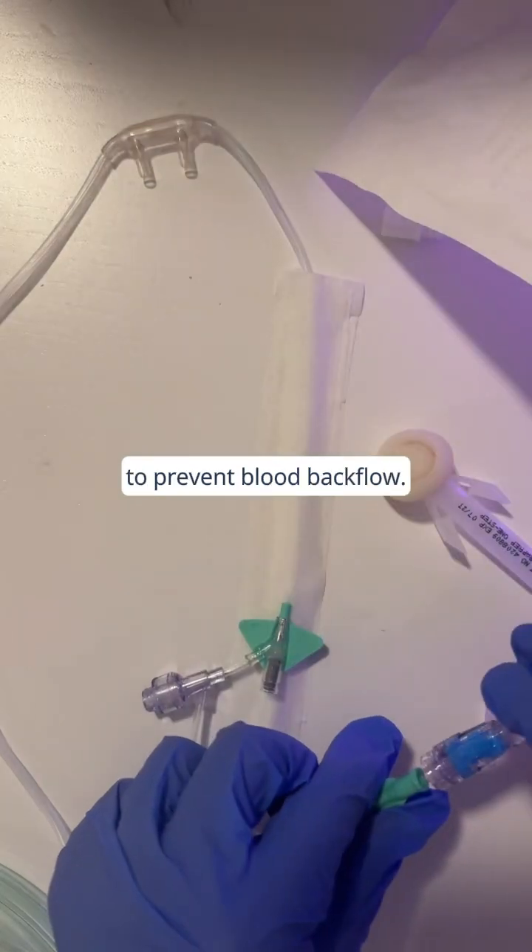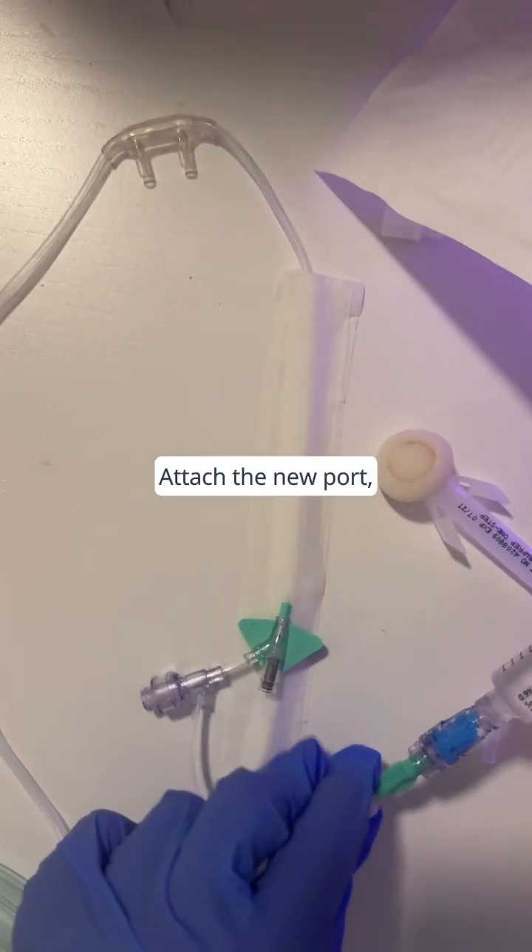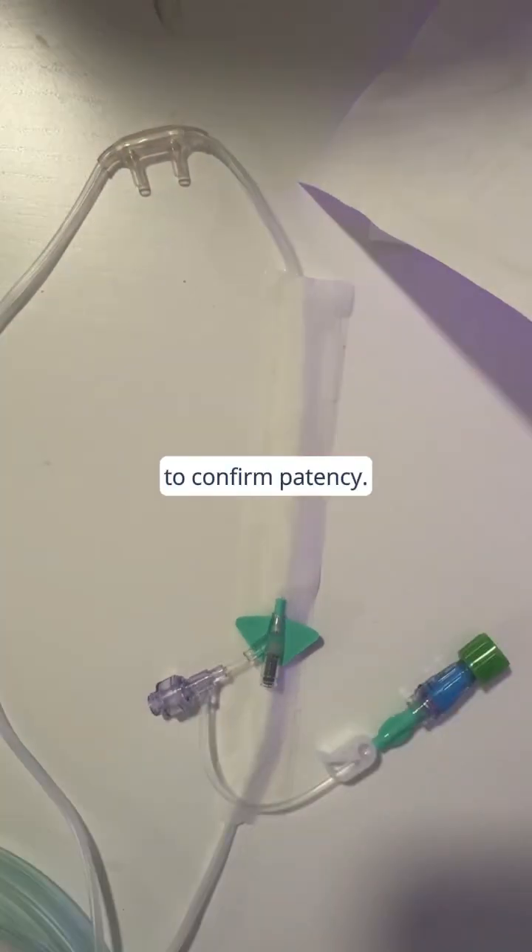Clamp the line to prevent blood backflow. Attach the new port, unclamp, and flush the line to confirm patency.